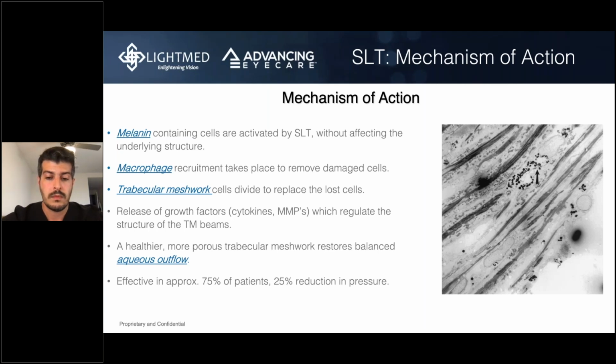Perfect. So how do you treat patients with pigmentary glaucoma or a history of uveitis? Do you lower the intensity and or number of shots, and by how much?